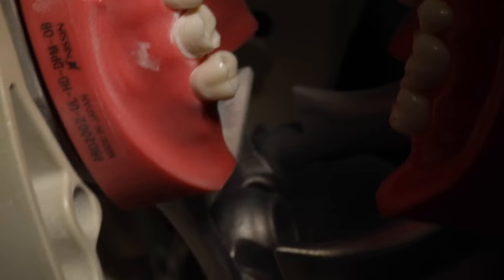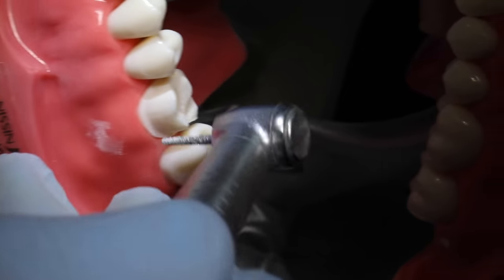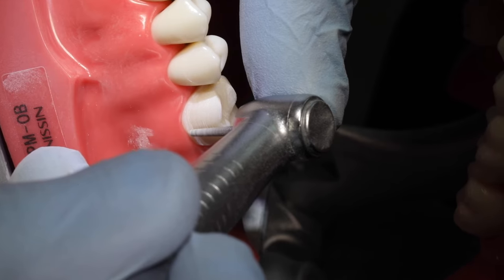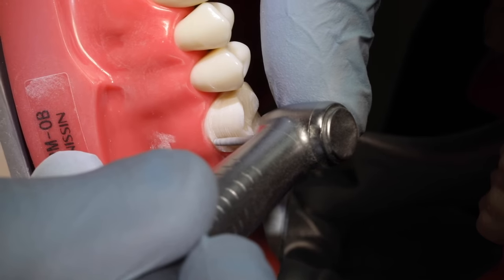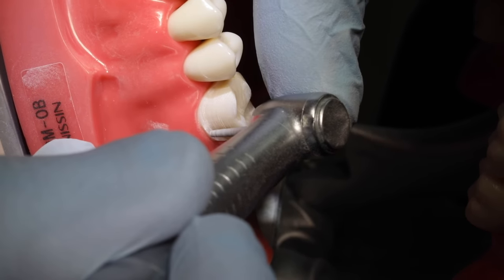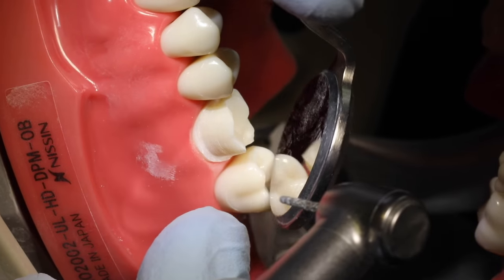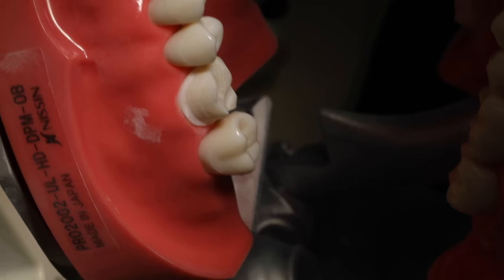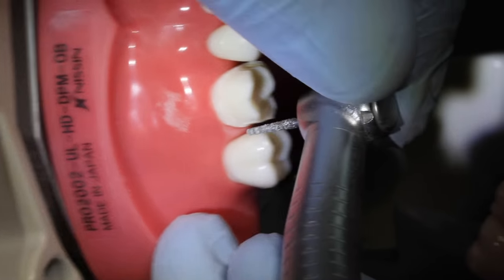Let's clean that off a little bit. There's a little bit of a lip starting right there, that little ski jump that we talked about. We'll make sure to take that off. And now we'll move in approximately. So again, we want to get direct vision on this. We'll go to the distal.